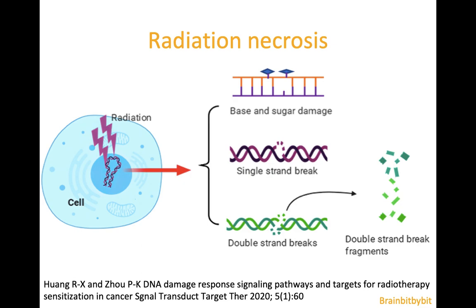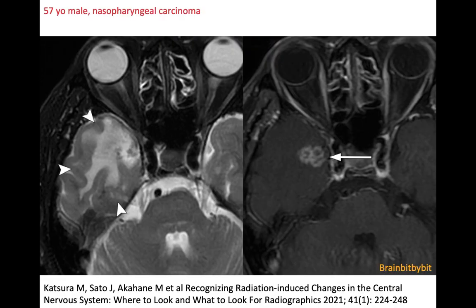I'm going to show images of radiation necrosis. Radiation induces DNA damage, leading to inability of cells to divide and to cell death. Radiation necrosis occurs months to years after radiation, so the interval is longer than in pseudoprogression that we discussed before.